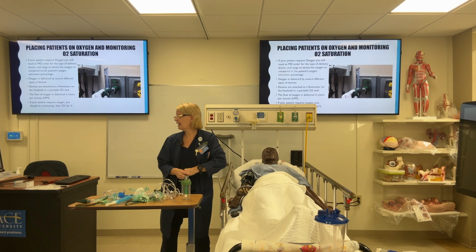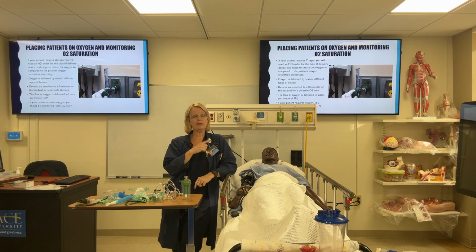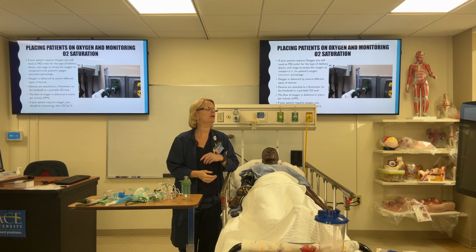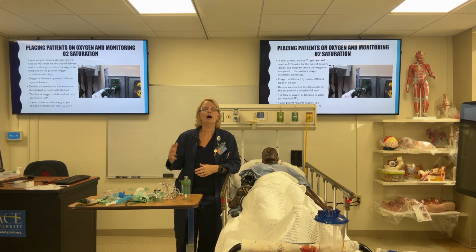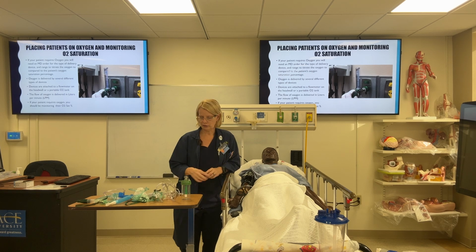So just so you know, oxygen does get connected to the head wall. The head wall behind me is obviously a portable head wall. In the hospital, the head wall is built into the wall. All the gas lines run behind the wall in the hospital, so your compressed oxygen, your compressed air, those kinds of gas lines are running in the wall. And we're basically tapping into those compressed lines through our oxygen flow meter.